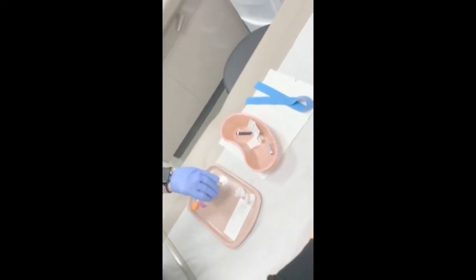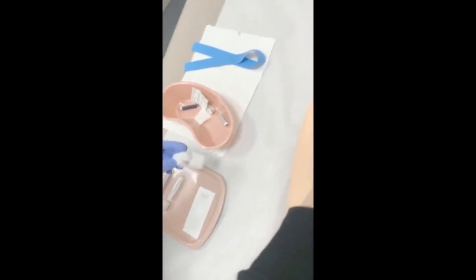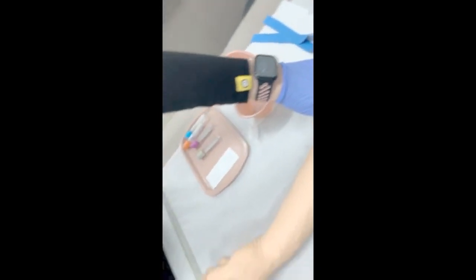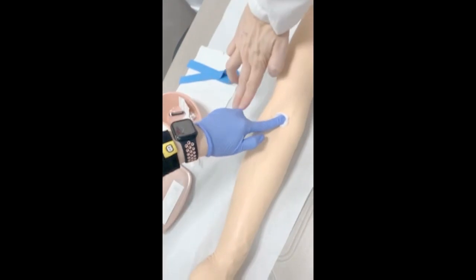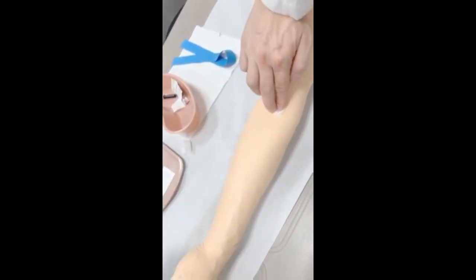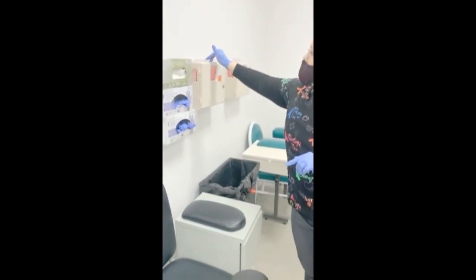The oxalate tube comes out and we invert it immediately so we don't forget. Set the oxalate tube down, grab a gauze pad, hold it right next to the site, pull the needle straight back and cover the site, activate your safety device, and ask the patient to hold pressure. As soon as the patient is holding pressure, immediately dispose of your sharps into a sharps container — never setting it down for even a second.